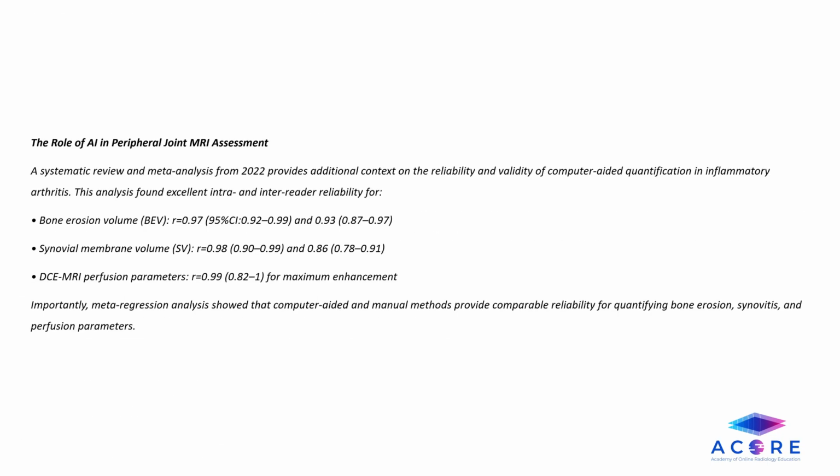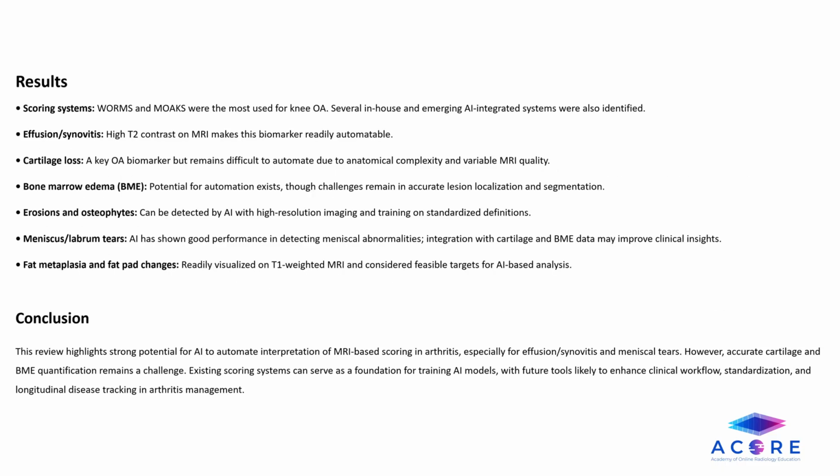In addition, there was a study published in 2022 which provided additional context on the reliability and validity of computer-aided quantification in inflammatory arthritis, and this found excellent intra- and inter-reader reliability for bone erosion volume, synovial membrane volume, and DCE MRI perfusion parameters. The meta-regression analysis showed that computer-aided and manual methods provide comparable reliability for quantifying bone erosion, synovitis, and perfusion parameters. So going back to the initial study, the results were very impressive.